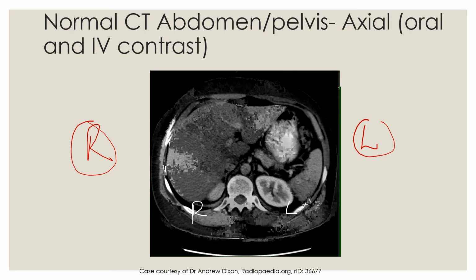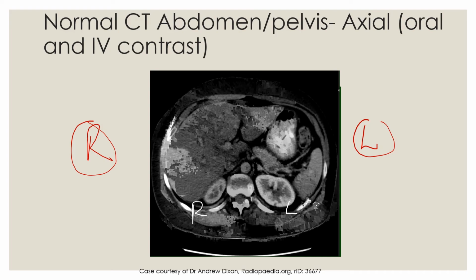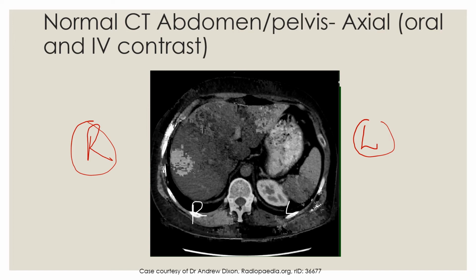Just above the kidneys, you should be able to see two adrenal glands. Your adrenal glands essentially are these kind of Y-shaped organs. And this one will also be like that. So just see if you can have a look at your left adrenal gland here. I'm just going to come in, just keep looking left. There we go. So there's our left adrenal gland here.